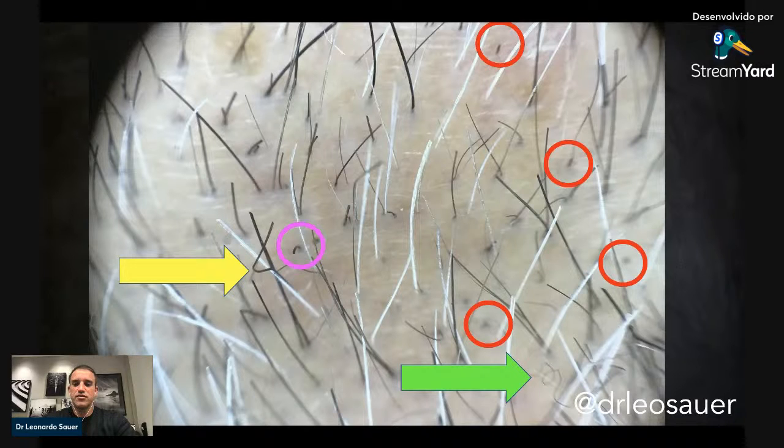The trichoscopy showed some abnormal findings like black dots, curly hairs, and cadaverized hairs, and we referred this patient to the dermatologist, who confirmed the diagnosis of alopecia areata. He is under treatment for this condition and also for androgenetic alopecia. At this moment, we are not going to perform the hair transplant in this patient.